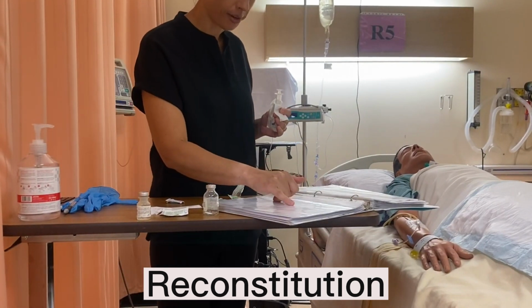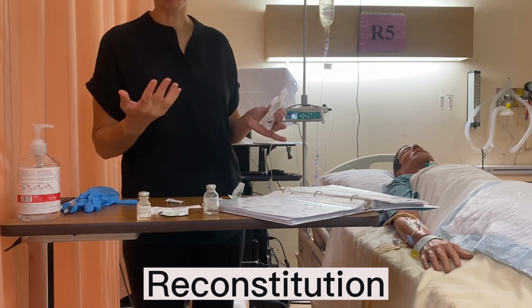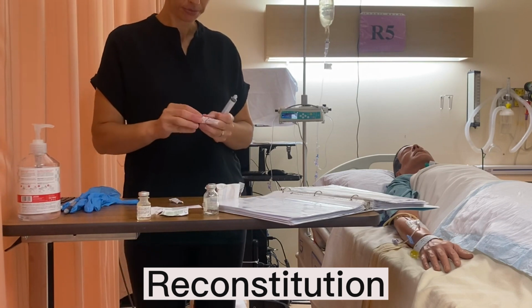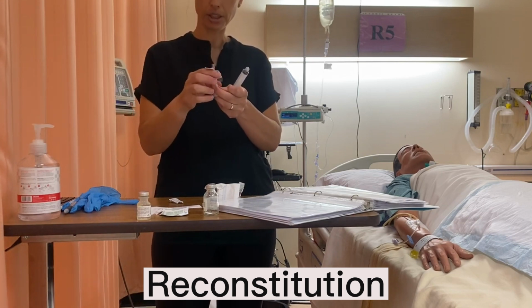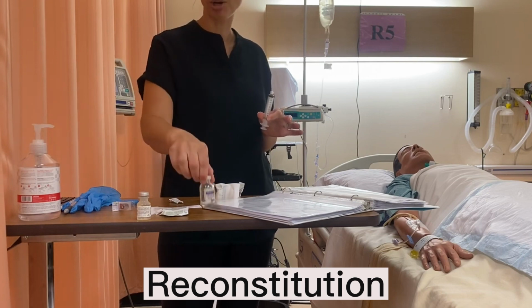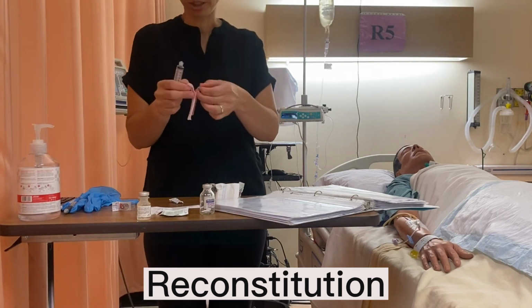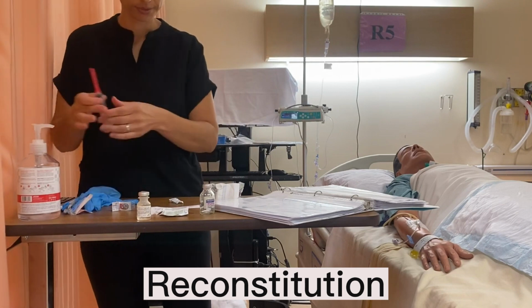So let's see, I'm going to need 10 mls. So you could pick a 10 ml syringe. You could use a 20 ml syringe as well. Either would be fine. Okay. And then we have our, oh, this is a filtered blunt fill needle. I don't need a filtered blunt fill needle because there's no glass particles. It's not an ampoule. So I'm actually going to go to my supply and find my blunt fill regular needle. I'm going to attach that.